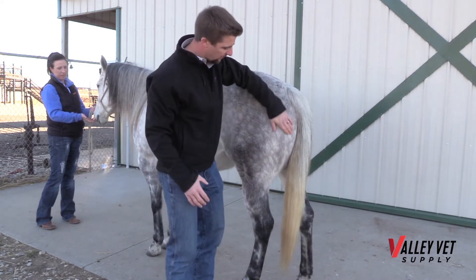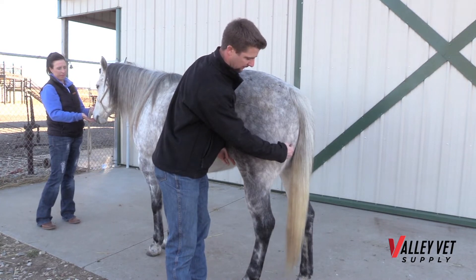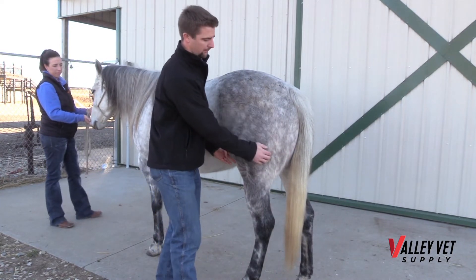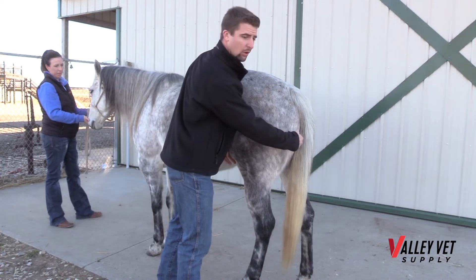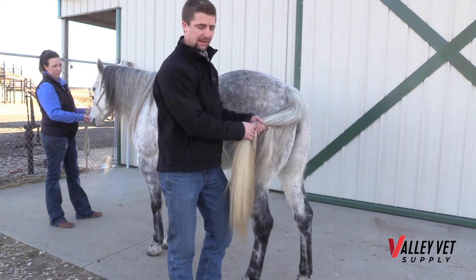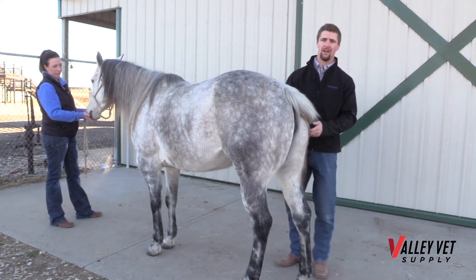The last place that we commonly administer a vaccine is right here in the muscles in the back. We need to be careful because a nerve runs right through here, so we want to make sure we stay close to the middle. Due to the risk of being kicked, we typically recommend standing on the opposite side and administering it into the opposite leg.